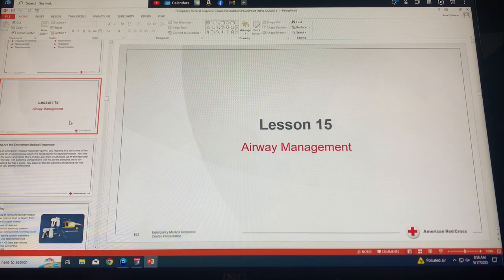In this lesson, you will learn the purpose and use of airway adjuncts, suctioning, and how to handle situations involving foreign body airway obstructions.